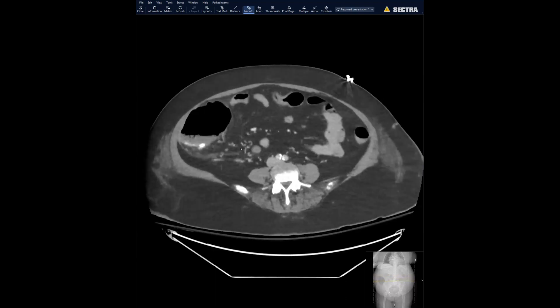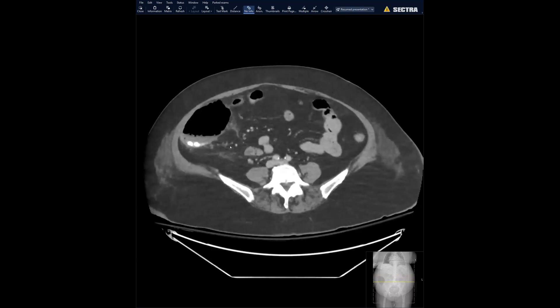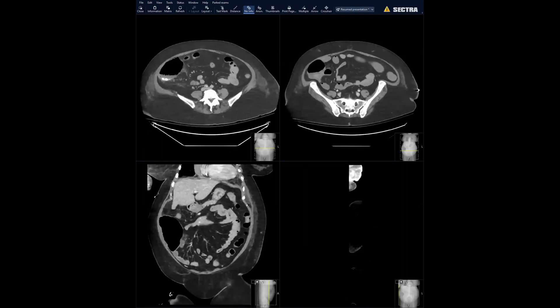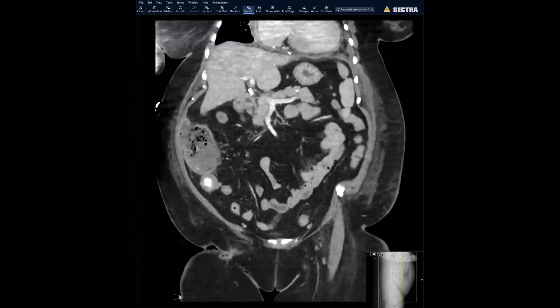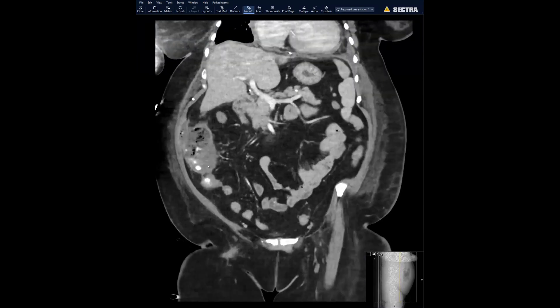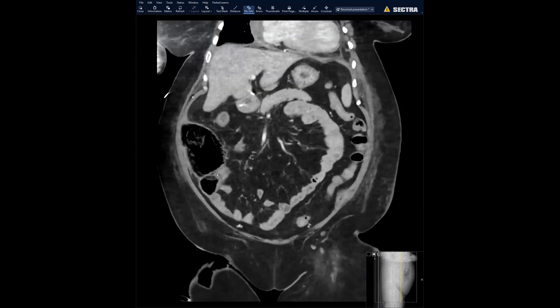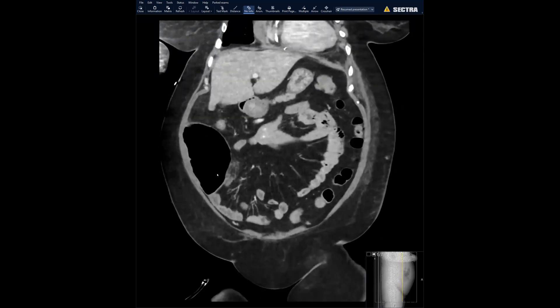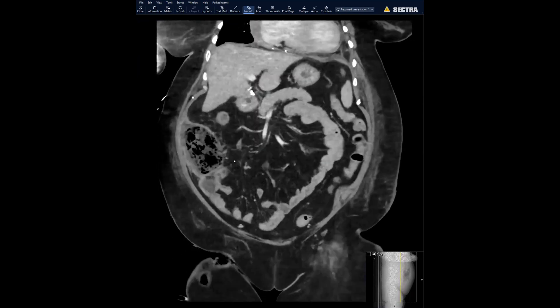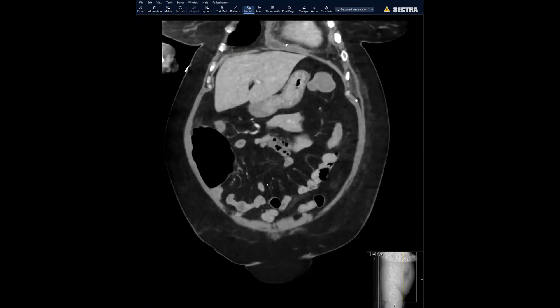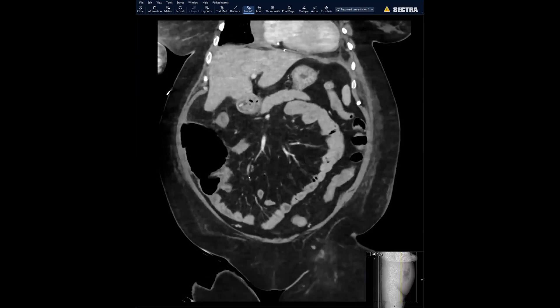On the follow-up scan the perforation was still there and the appendix was even inflamed. Reformats are important — when we run the bowel we should always look at reformats. It's a good reminder to look outside and follow the contours of the wall. Enhancement-wise, prospectively we probably could not have called it ischemic — we're in such a late phase that not a lot of the other bowel is enhancing as much.